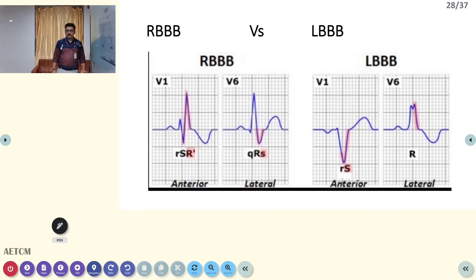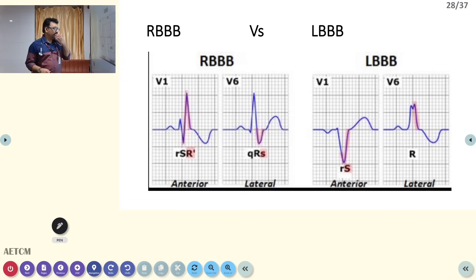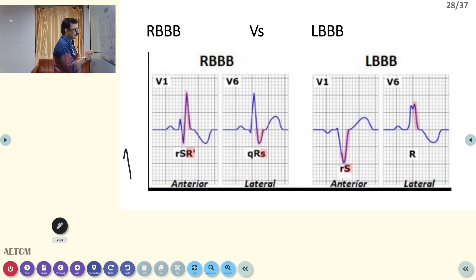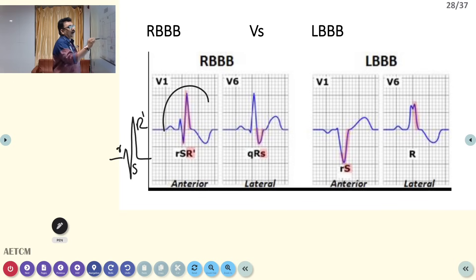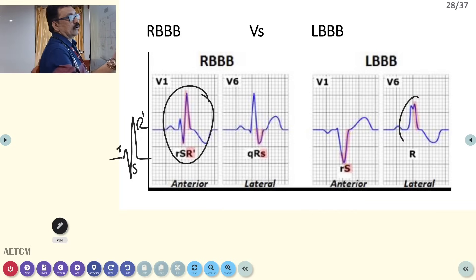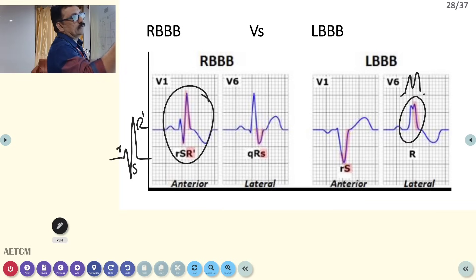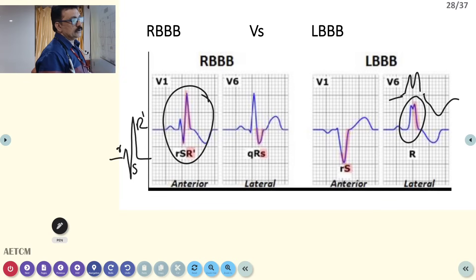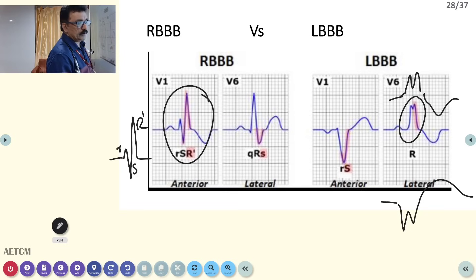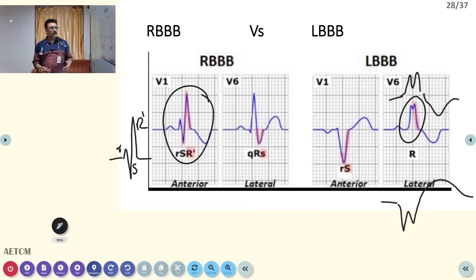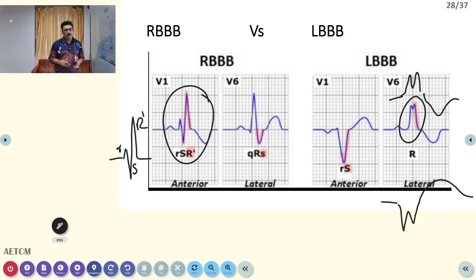Both LBBB and RBBB produce wide QRS complexes. RBBB shows an RSR' (R-S-R prime) pattern in V1. LBBB shows a wide, notched M-shaped QRS complex with ST depression and T wave inversion; sometimes a W pattern with ST elevation. RBBB is mostly an innocent finding, but LBBB is always pathological — most often indicating ischemic heart disease. Acute LBBB should be considered as myocardial infarction.